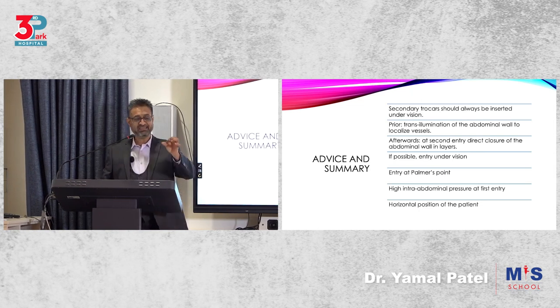And if it is anything bigger than 10 millimeters, always close it from the inside out. Don't close the skin and leave it, you'll get a hernia.